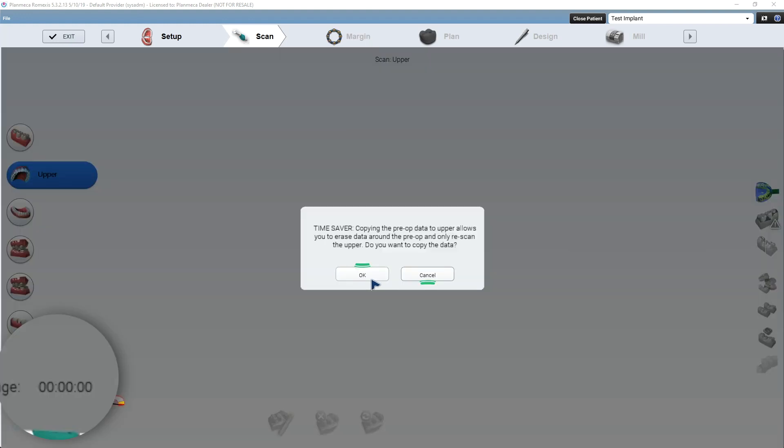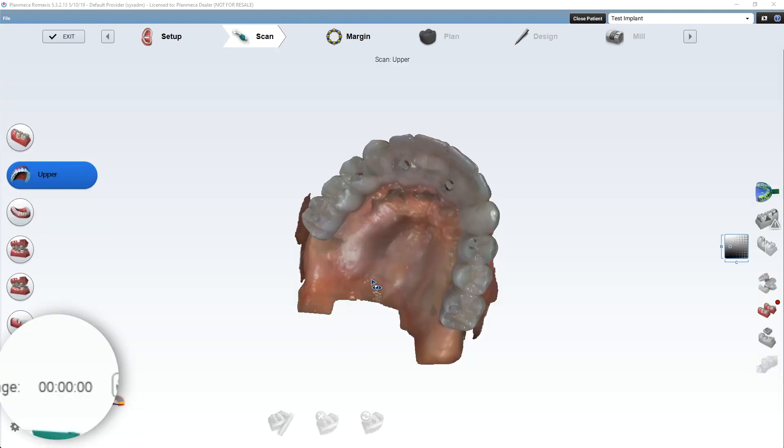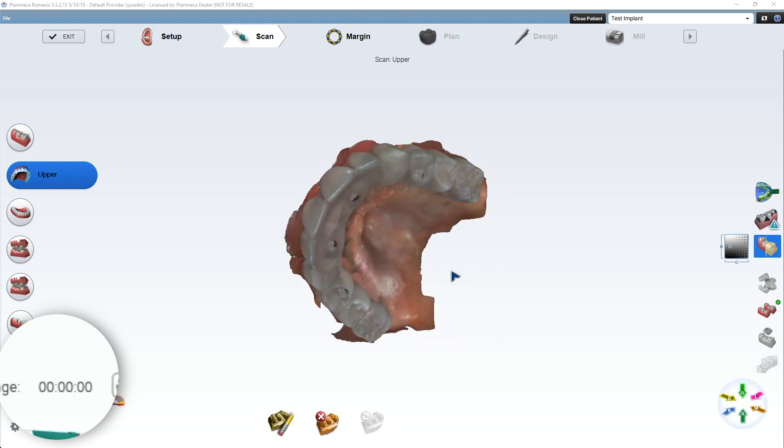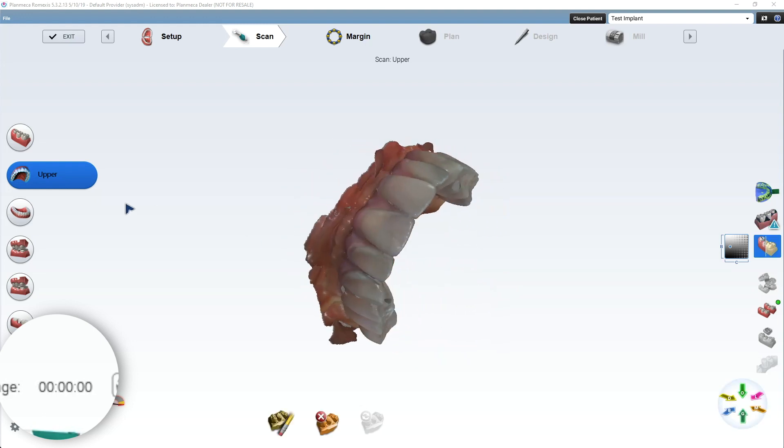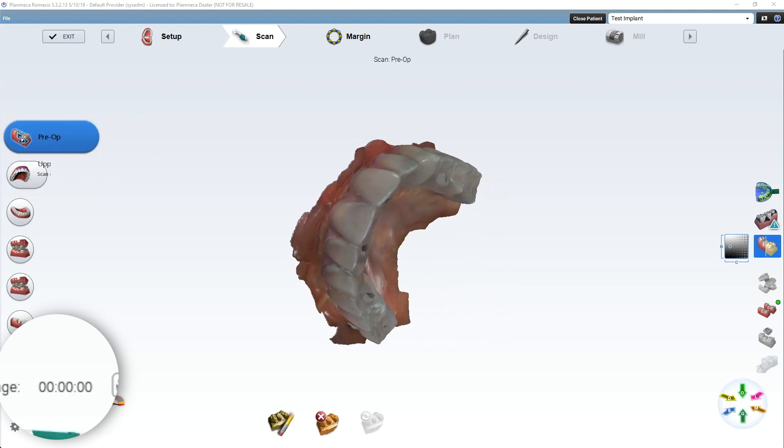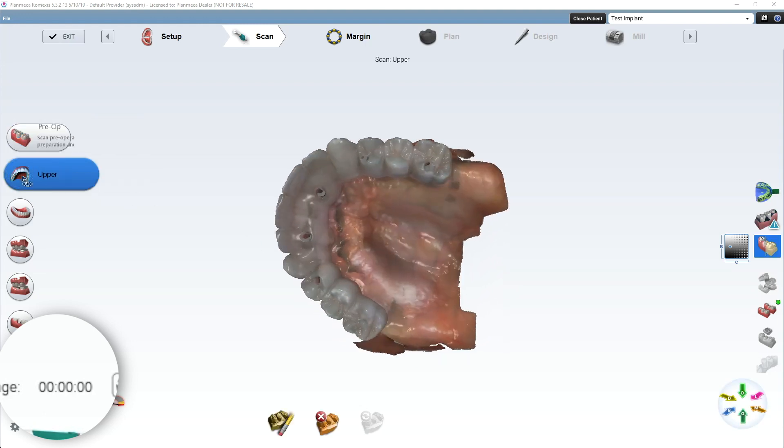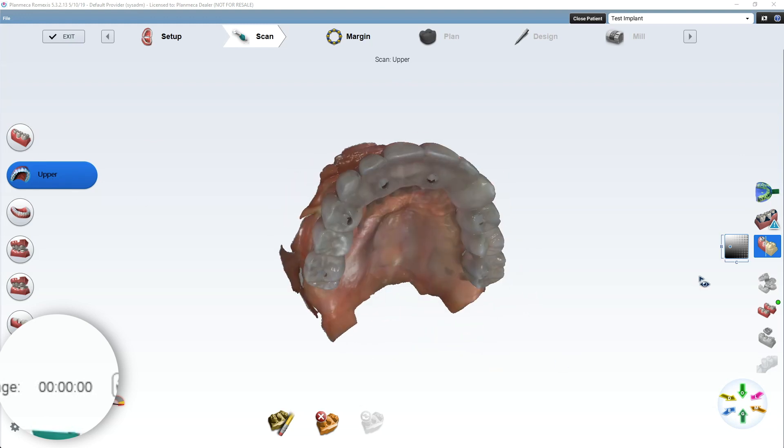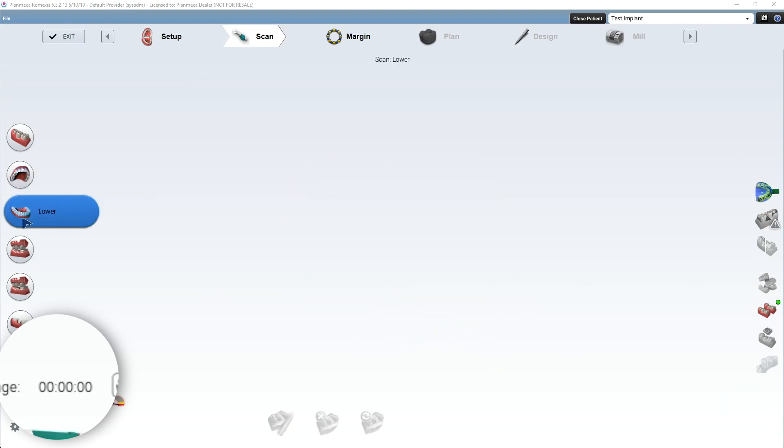Now, okay, so I hit okay, and it's going to recopy the pre-op down into the upper. So now I have two arches. So I have the pre-op. It looks like that. Okay, and I'm going to keep that like that. Then I have the upper.